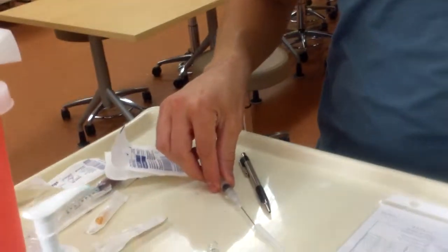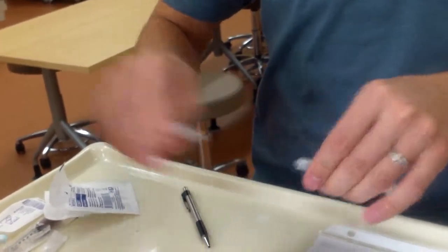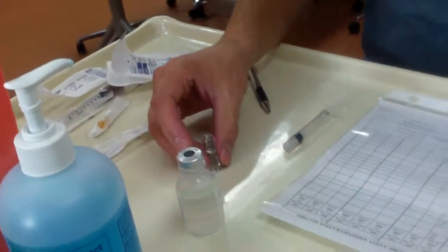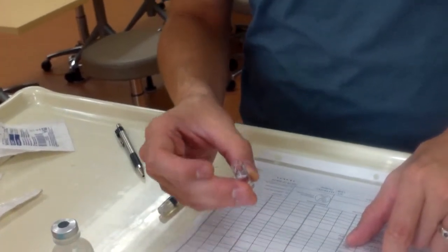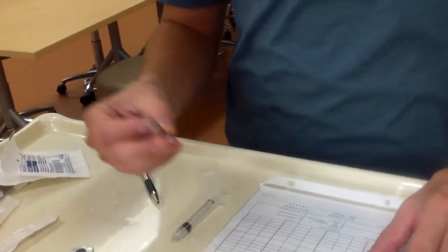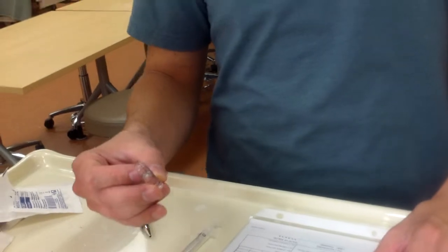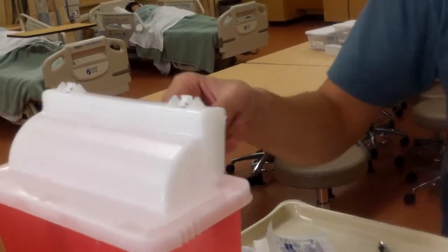And then I need to take my filter needle off. I'm going to scoop that up and then put that in the disposal. And then I have the right medication upon the second check. So now this is extra, and I double checked it along with the second check and the 5 rights, and then I'm going to do the third check on this, make sure I have the proper medication that I administered from the vial, and I am then going to make sure I have the 5 rights: time, route, dose, medication, patient. Then I'm going to dispose of this because I don't want glass out. So that's my third and final check, and then I'll get rid of that.